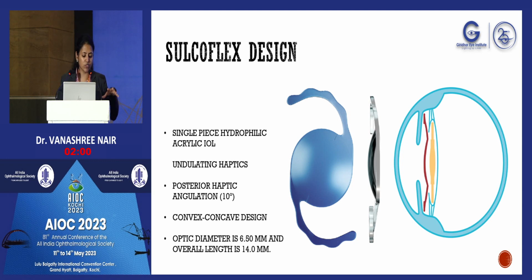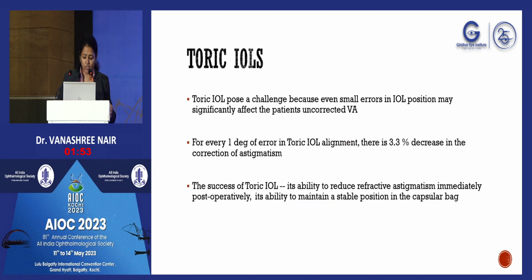This optic diameter of 6.5 actually prevents optic capture by the pupil once you dilate in the post-operative period, which is one of the problems that can happen with piggyback IOLs.